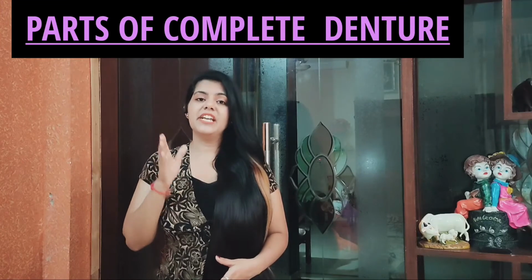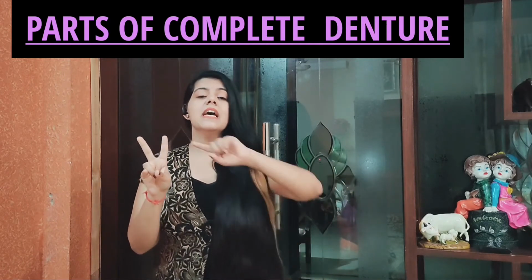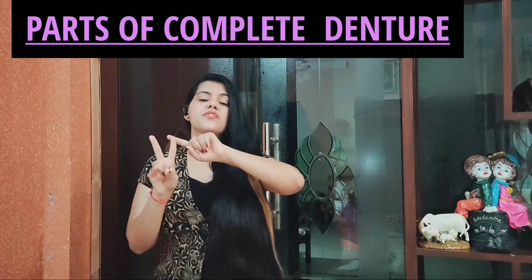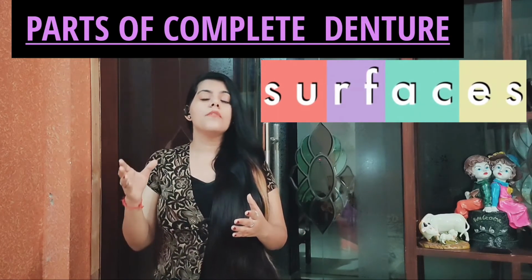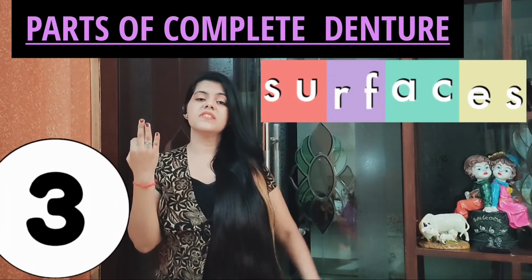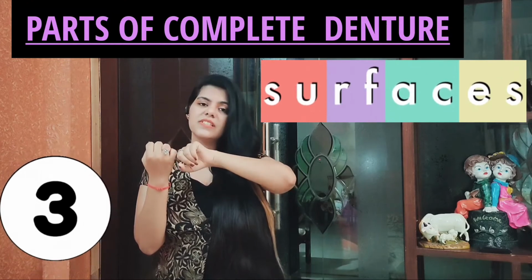Now today's topic is the parts of complete denture. Whenever we talk about the complete denture, it is divided into two things. One is surfaces and second is the components. There are 3 surfaces and 4 components. So begin with the surfaces of the complete denture. As we know that there are 3 surfaces, that is impression surface, polished surface and the occlusal surface.